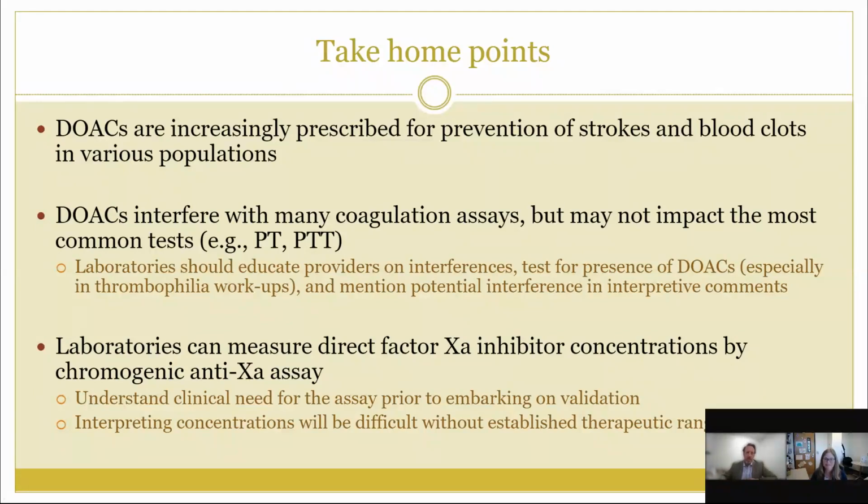And then you should also show that significant levels of apixaban could still produce a normal APTT result. And I guess that confounds the issue of somebody presenting on one of those direct anti-10A inhibitors. Do you find this is a common issue with patients presenting on one of these inhibitors?